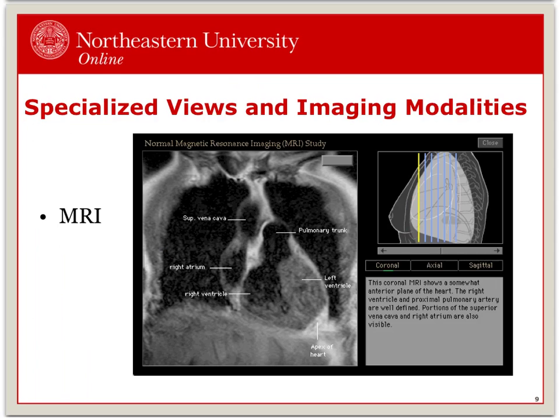Coronal views are helpful in identifying the size of the ventricles and coronary artery disease. Please take a moment to identify the anatomy.